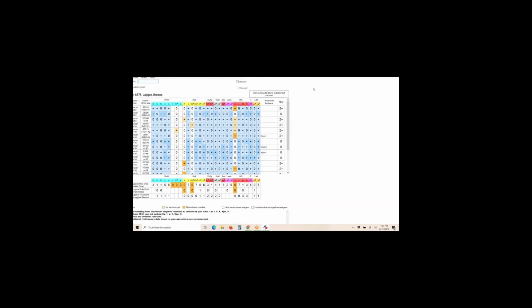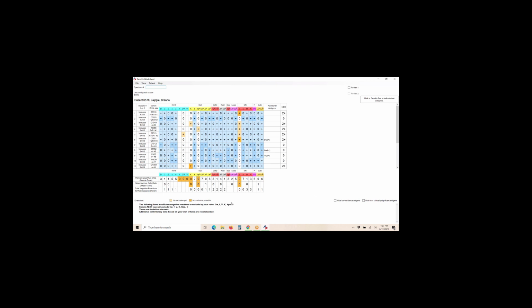Let me move this and make it large. And we're still going to have some of the issues that we had before, except now the E is gone. It's been excluded with one cell. So that kind of cleaned things up a little bit. We're still having the problem with the F, and we still have the issue with the lows. If we remove the lows though, we can see that F down here is the only thing that's a problem overall. And where's that result coming from? The only column we've tested on is the NEO. Okay.